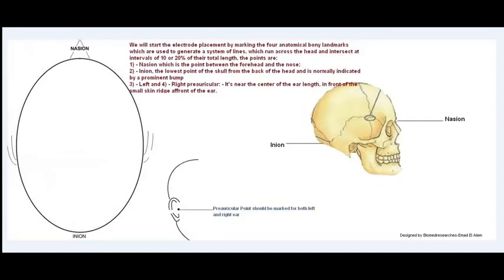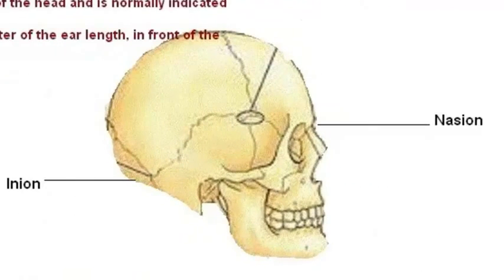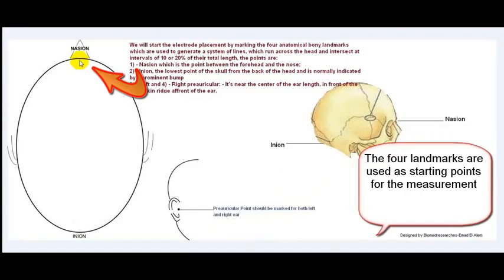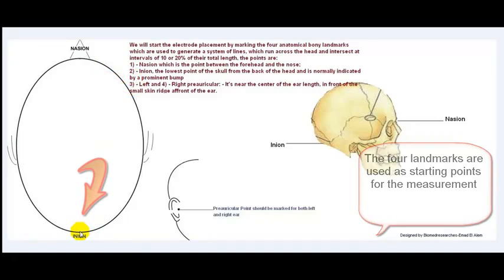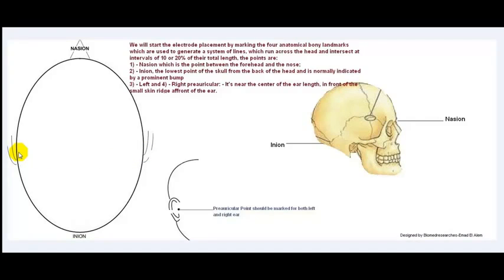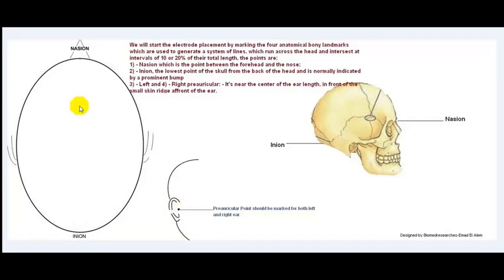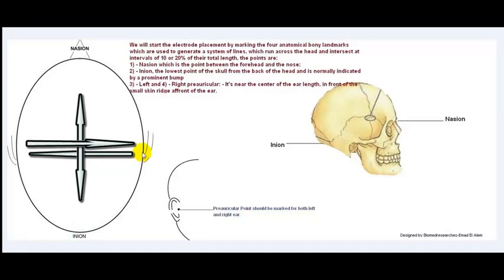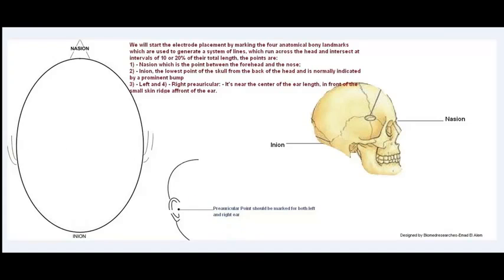We will start the electrode placement by marking the four anatomical bony landmarks. These are landmarks where we will not connect electrodes, but we will use them as a starting point for the measurements. The four landmarks are: the nasion, which is the point between the forehead and the nose; the inion, which is the lowest point of the skull from the back of the head, normally indicated by a prominent bump; and the left and right preauricular areas, located near the center of the ear length in front of the small skin ridge in front of the ear.